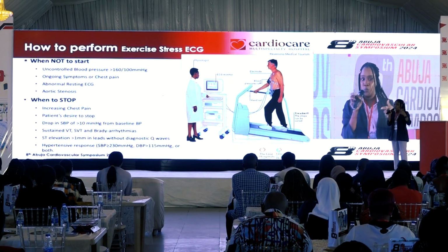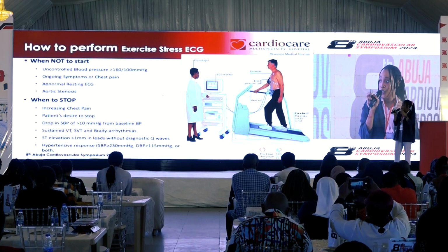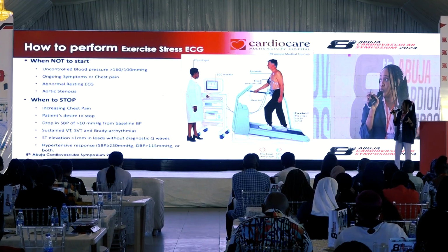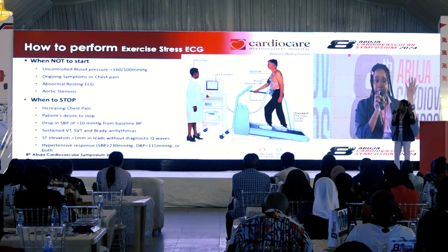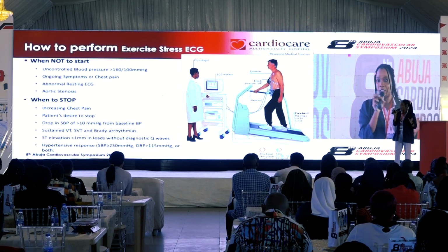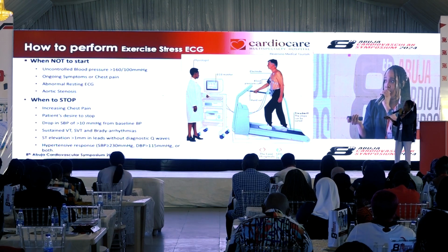Another one is a drop in systolic blood pressure of 10 millimeters of mercury from baseline. That's why it's very important to do your baseline ECG. And also, I did mention, while the test is going on, we check the blood pressure after every 3 minutes. It's very important so that there is no dipping pattern. The normal response to stress is elevated blood pressure, but instead of going up, it's now going down. That's a red flag, and we should terminate the test immediately.